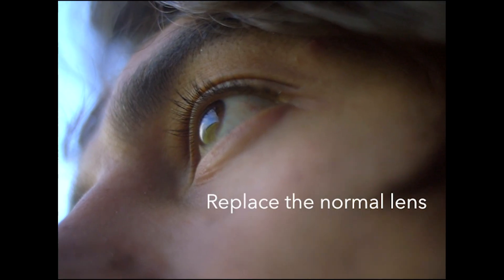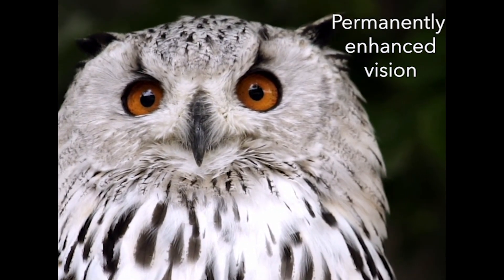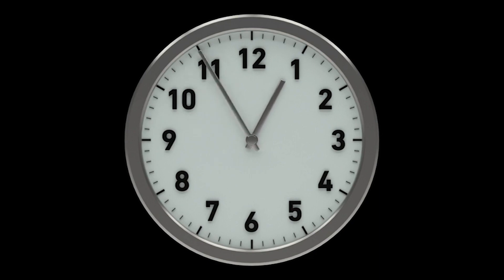These lenses essentially replace the normal lens of the eye, which would otherwise decay over time, giving you 3x 20-20 vision forever. This means that if you can't see the clock from 10 feet away, you'll now be able to do it from 30 feet.